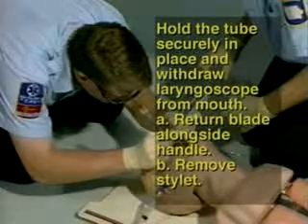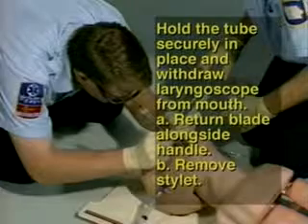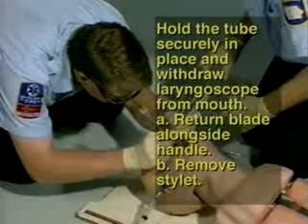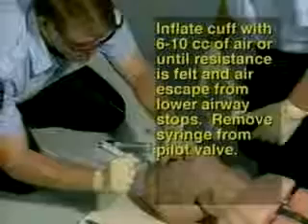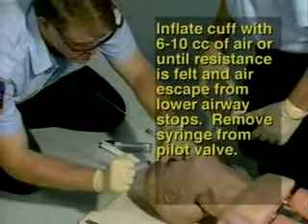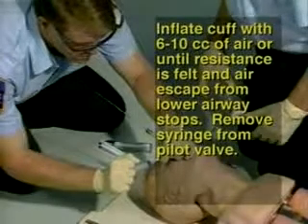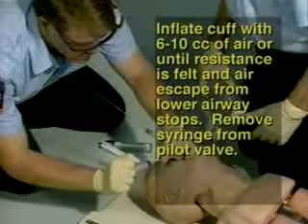Step 15: Hold the tube securely in place and withdraw the laryngoscope from the mouth. Return the blade alongside the handle, turning off the light, and remove the stylet if used. Step 16: Inflate the cuff with 6 to 10cc's of air or until resistance is felt or air escape from the lower airway stops. Remove the syringe from the pilot valve.